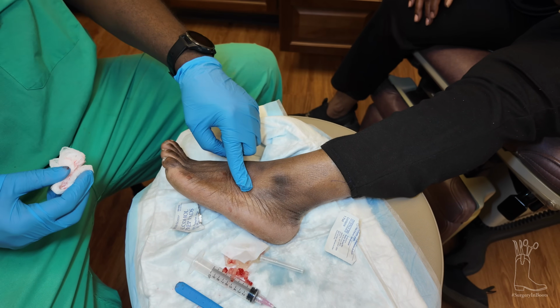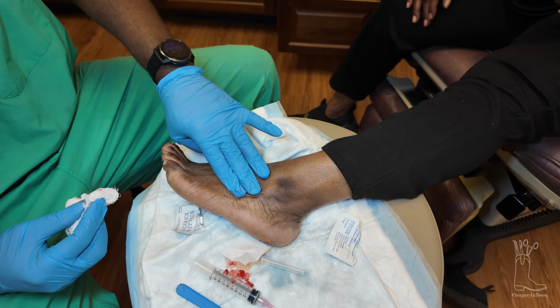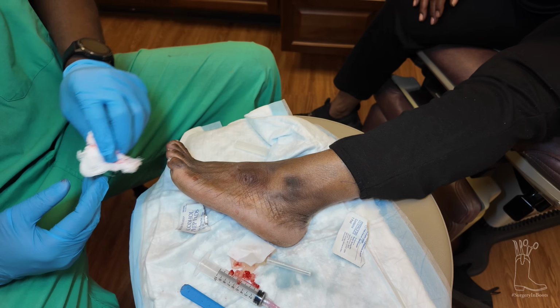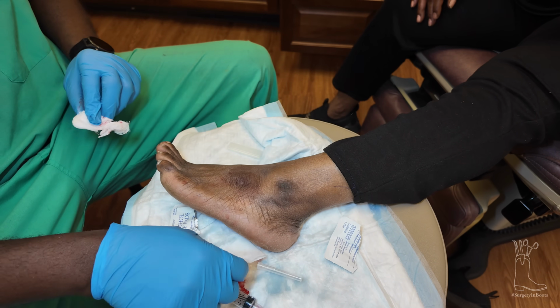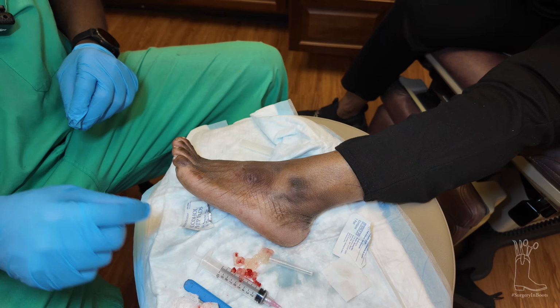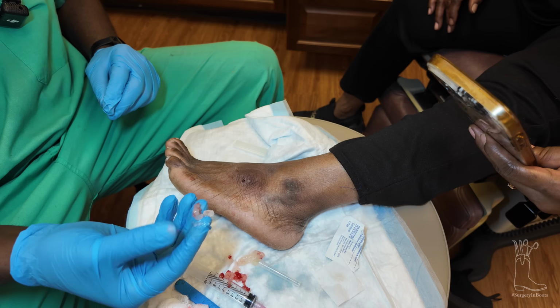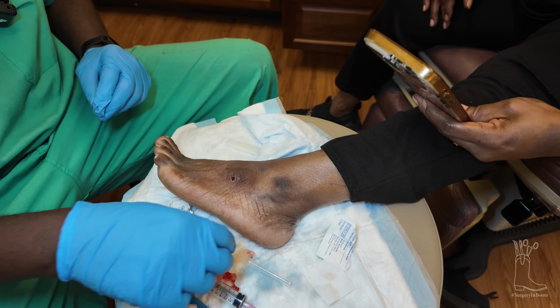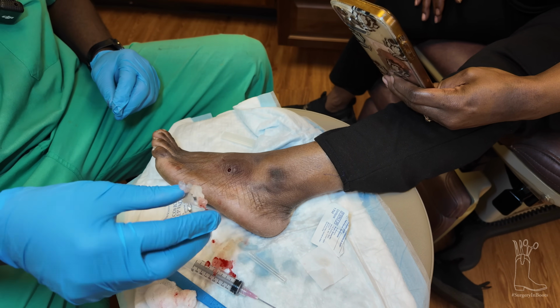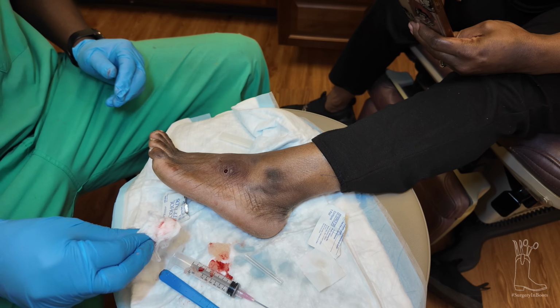So we're gonna get a little wrap in here, wrap it up, and then what you're gonna do is keep that wrap on there tight, so that it keeps it flat and doesn't fill up. So do I need to put like after treatment? Just put some bacitracin on or Neosporin or something like that. Okay. But this is the stuff. This is just joint fluid. See how sticky it is? I don't want to touch it. Stop. He did squeeze it. Just like little jelly. That's why it was hard. Yeah, that's why it was so tense, because it was just leaking out.